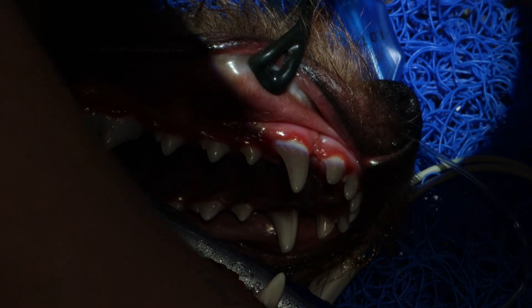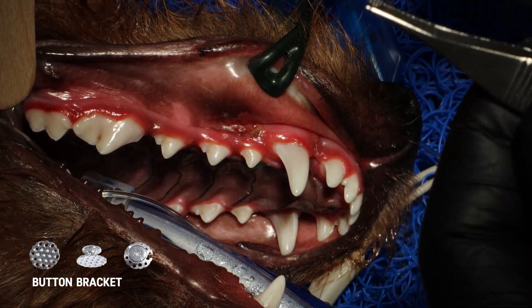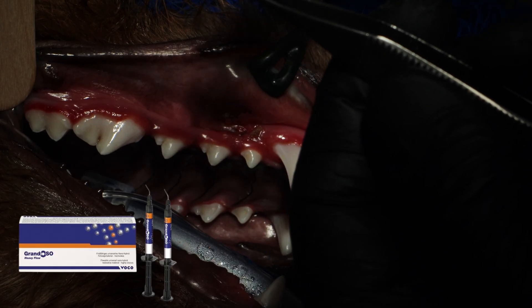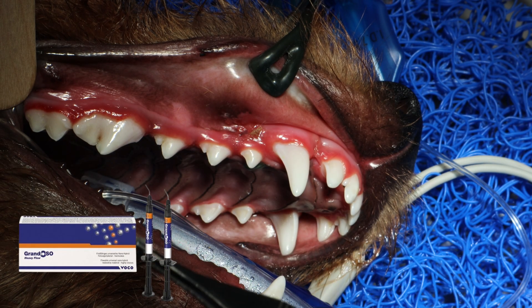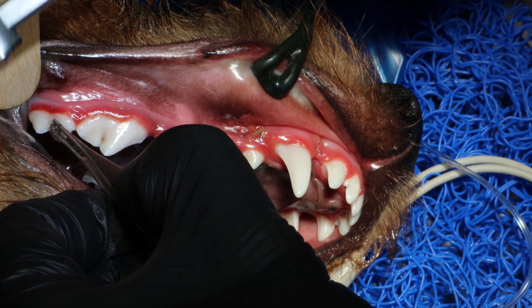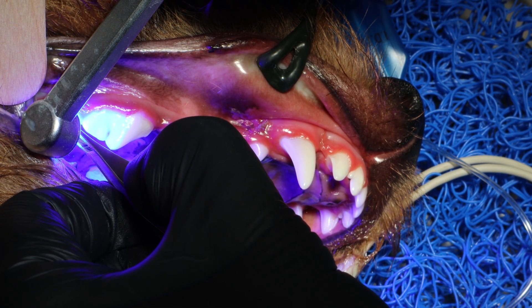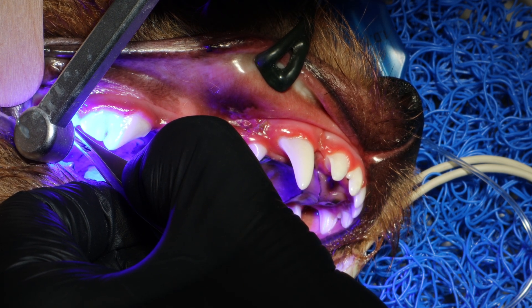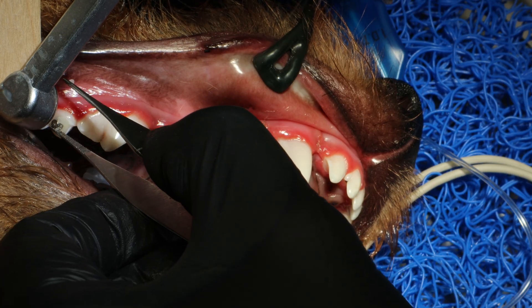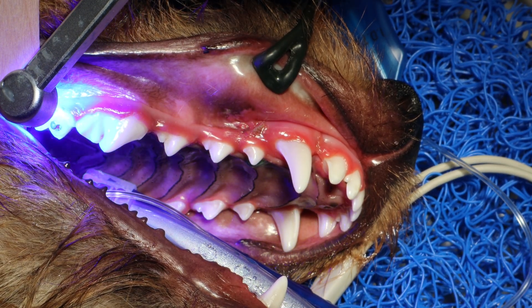Once you're done light curing, you're ready to apply the buttons. I like to use lingual buttons that have holes in them because they catch onto the composite much more easily. This is the flowable composite I'm applying. You just place the button on a smooth, even surface — find a spot with no curvature. You don't want the button sitting on a peak, so to speak. You want the base to be even so all of the button is touching the tooth. Then just release the forceps and light cure a little bit more.